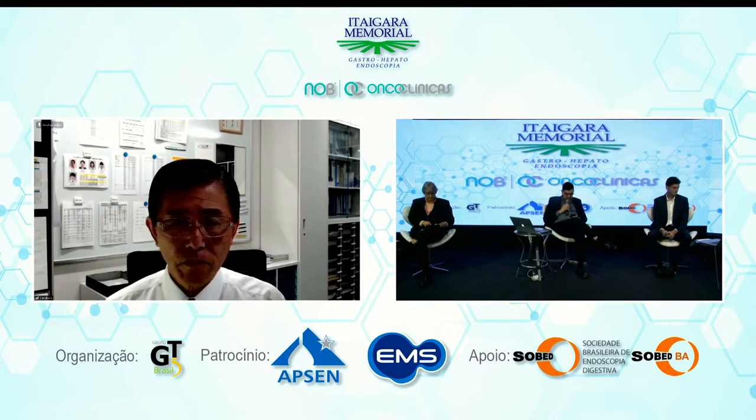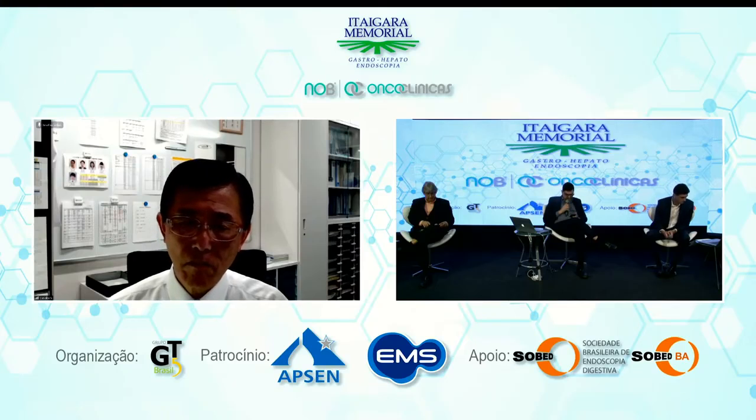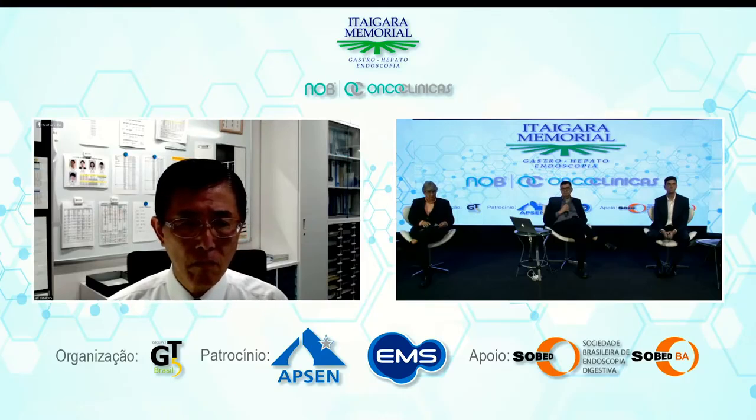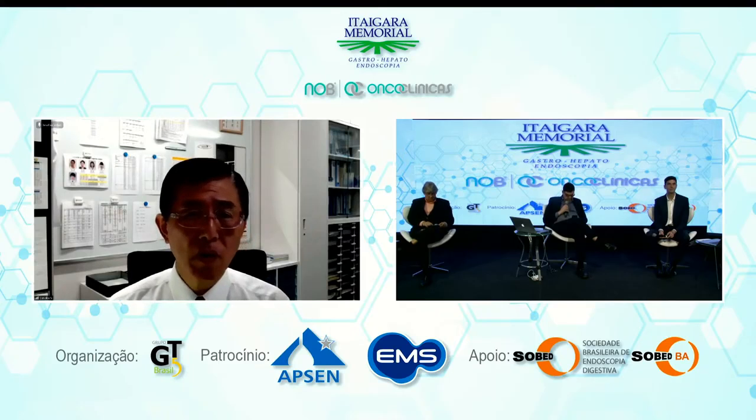A question from Daniela from Goiânia regarding NBI technology to improve endoscopy and characterize the colon cancer. What should be good for the Brazilian reality? JNet? For the Brazilian reality, do you think that JNet would be suitable? Yeah, of course. JNet is very simple.